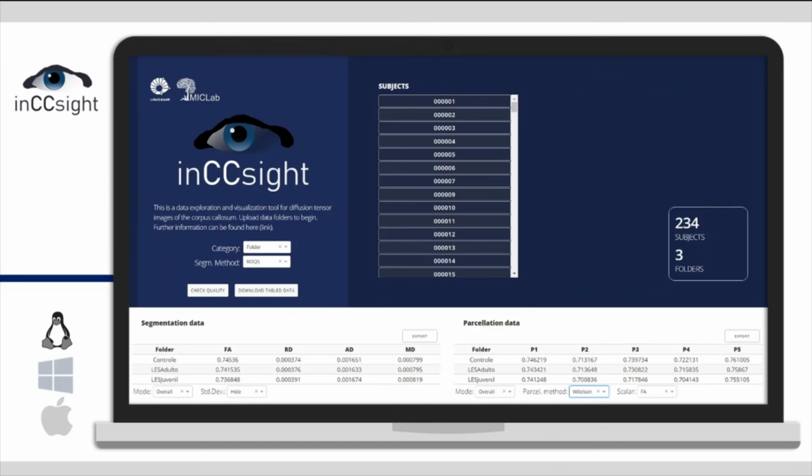In conclusion, we believe all these functionalities can help researchers all over the world to perform Corpus Callosum studies in DTI in a practical, reliable, reproducible, and repeatable fashion, without the need to code or use several programs. We also believe that our dashboard allows data exploration and may help researchers discover new and meaningful information about this unique structure.